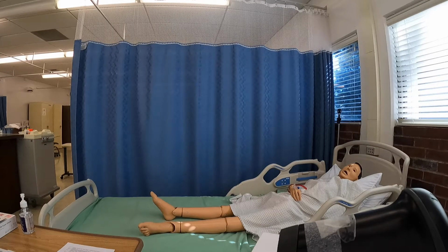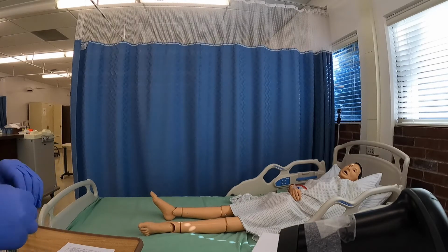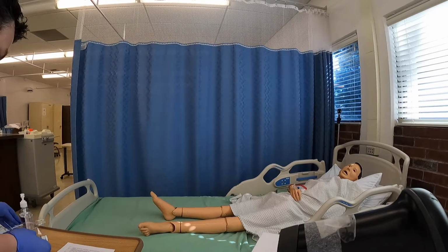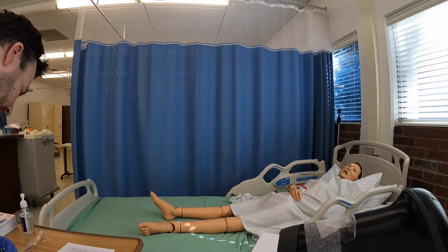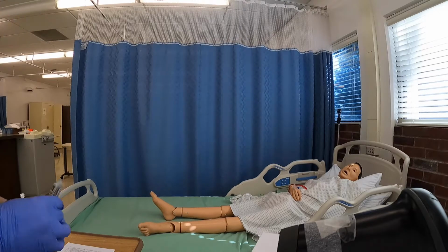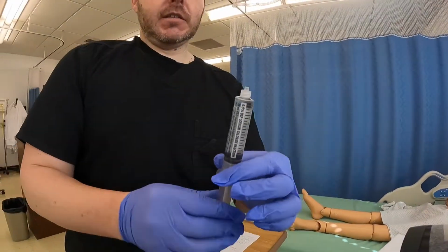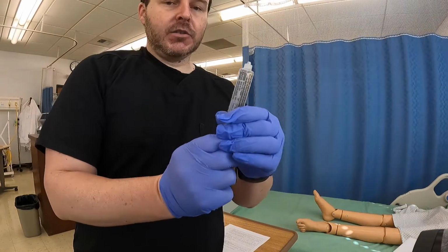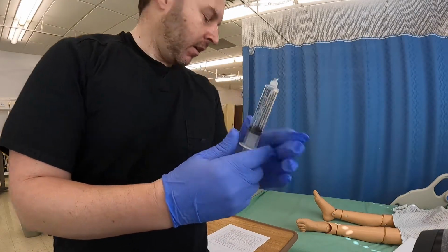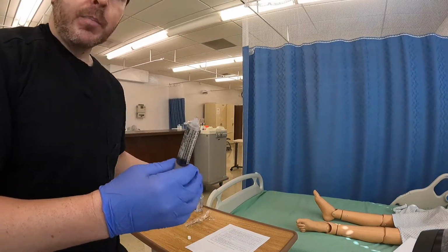And before I hook him up, the one thing I need to do is check his IV to make sure it's patent and there is no issue with that. So I want to assess that IV site for redness, swelling, or tenderness. To do that, you need to have your saline flush, which I just got out of the package. There's a little bit of air, so I'm going to get that air out. Perfect. And then I have my alcohol swab.